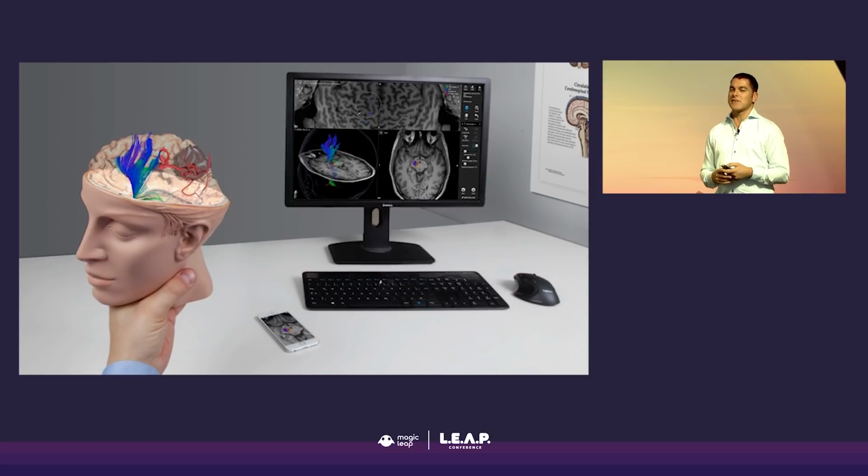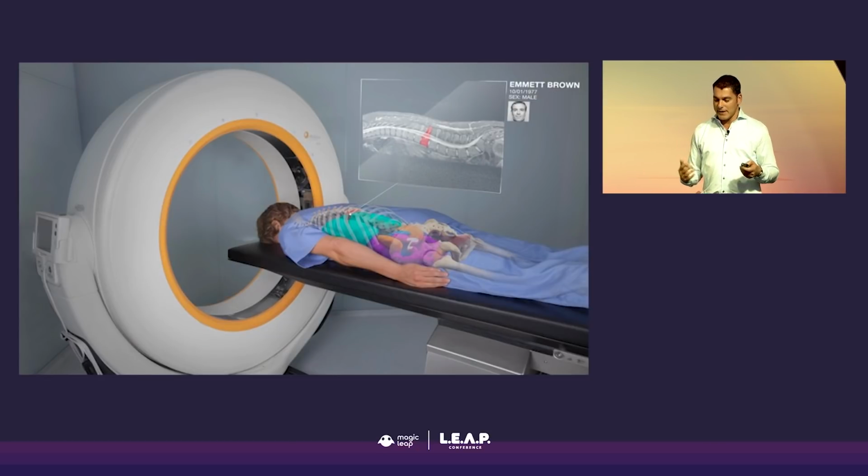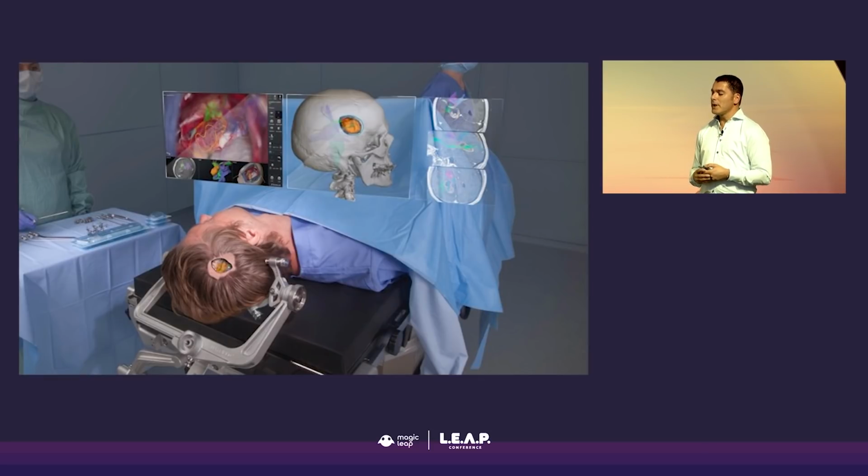In our vision, we want to first start with planning and show how we can map the anatomy of an individual patient onto a specific model that we can turn and simulate and use for planning procedures. If you use that in an intraoperative environment, or if you take another scan, we're able to use all this sort of automatic anatomical mapping in the background to make the skin of the patient translucent. You'll be able to just look at the patient from different angles as if you have X-ray eyes. In the operating room, we can bring this concept to also show the craniotomy before it was done and condense and integrate all the different information from different workflows. So we can make it sensitive and specific to a particular workflow.